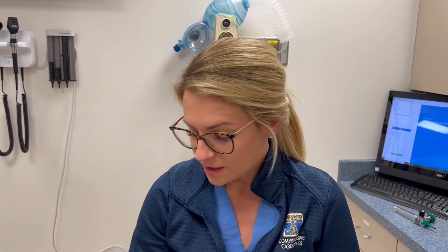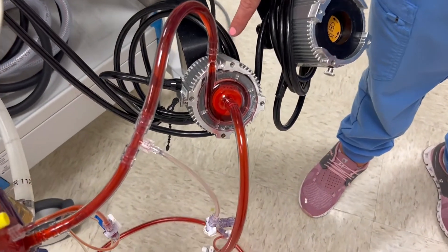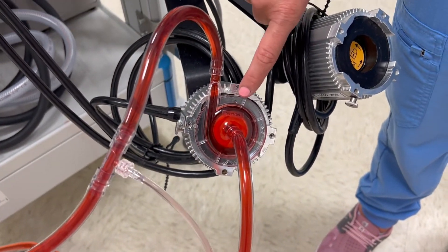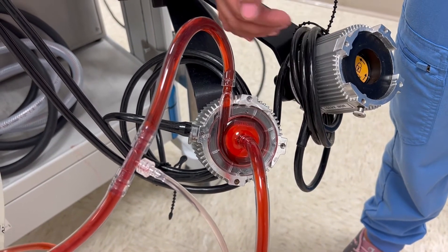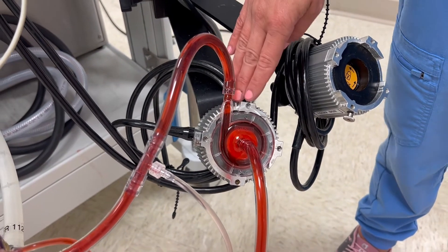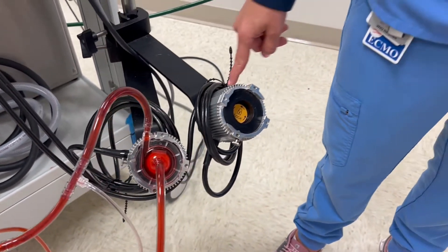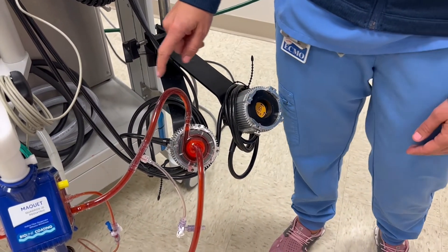Now let's walk through the main components of the ECMO system. The first component is the pump head. The pump head is housed by a motor that has a giant magnet inside. The magnet levitates the propeller inside the pump head itself to bring blood in and propel it forward, highly oxygenated, back to the patient. The pump motor also has a backup motor should the main one fail, so we can move one console to the other and get it working back in order.